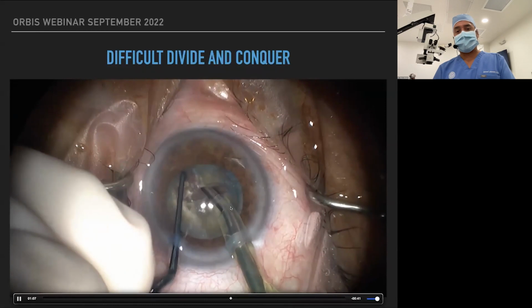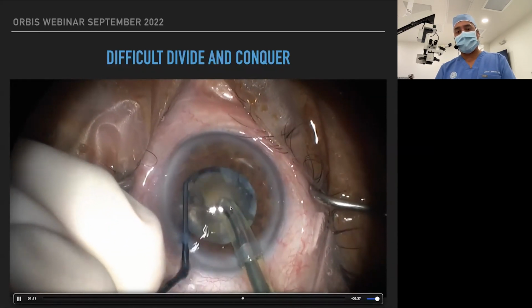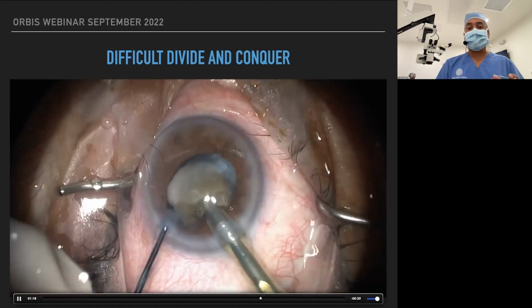Yeah, now we're gonna try to remove it. Now, with my left hand, I'm holding back that part that it's attached to, hoping it can peel up. So I freed up one quadrant. Once you free up a quadrant, you're good. But I couldn't crack the other one.